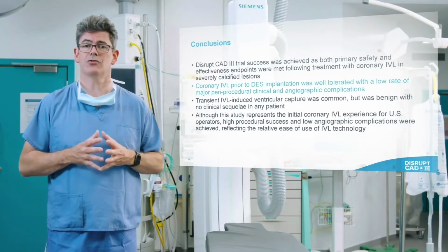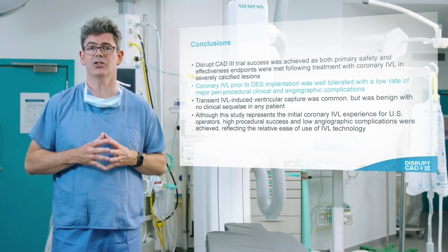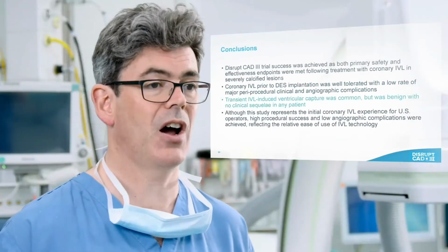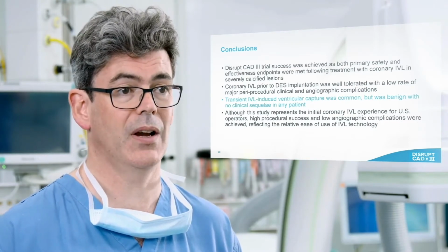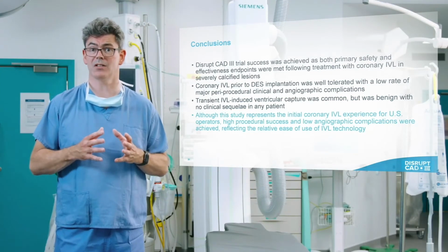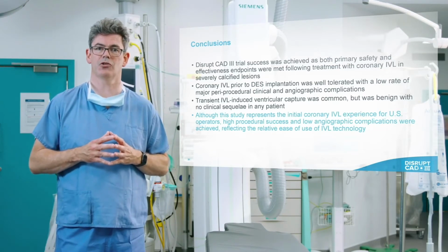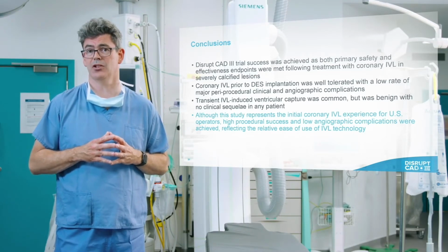Coronary IVL prior to drug-eluting stent implantation was well tolerated, with low rates of major periprocedural clinical and angiographic complications. Transient IVL-induced ventricular capture was common, but was benign, with no clinical sequelae in any patient. And although this study represents the initial coronary IVL experience for US operators, high procedural success and low angiographic complications were achieved, reflecting the relative ease of use of IVL technology. Thank you for your attention.